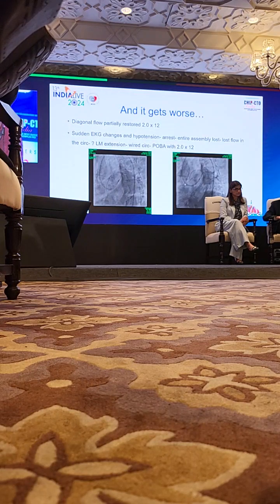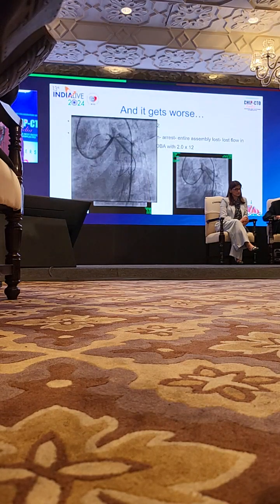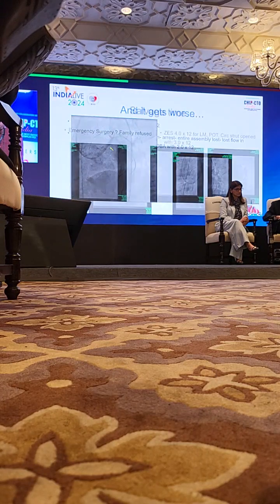We took immediate femoral access, took a fluoro shot, which is not shown here, which had shown circ to be compromised. We quickly wired the circ, POBA into the circ, got some flow back. On the right, I want to take your attention to the video on the right over there. We looked at that shot and we thought perhaps the haziness there was probably due to dissection, either guide induced or retrograde extension of the dissection.